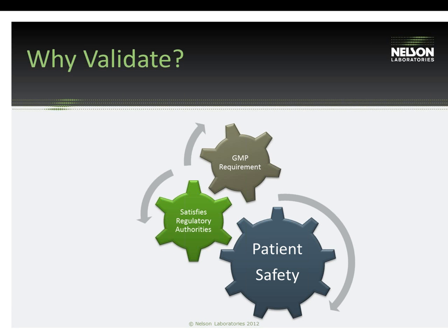So why is it important to validate? First, it's important to know that this is a requirement. It's a GMP or good manufacturing practice requirement that manufacturers shall have procedures in place for the use and removal of such manufacturing material to ensure that it's limited to an amount that does not adversely affect the device's quality. And so it's important to note that this is actually a requirement.